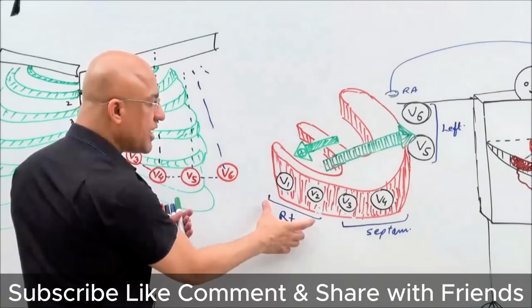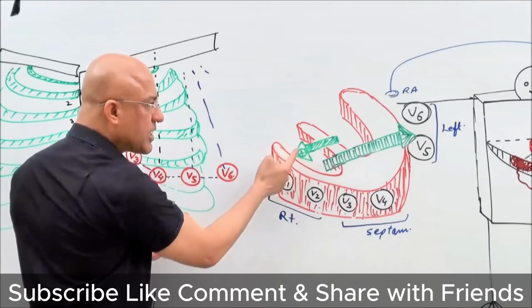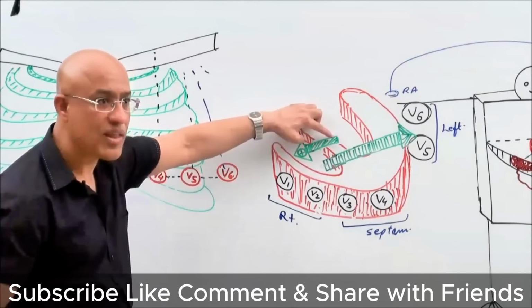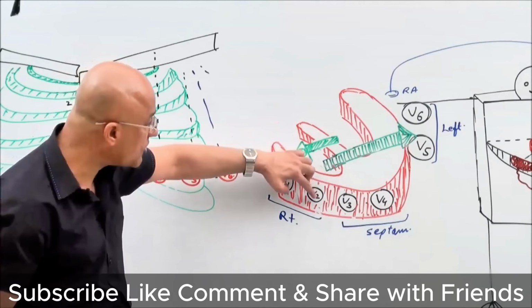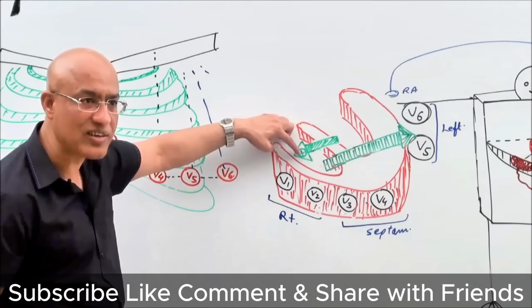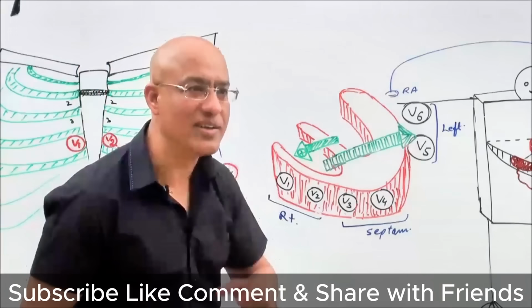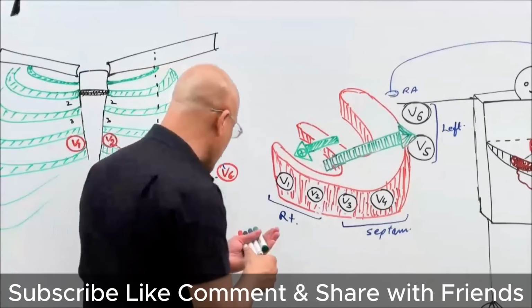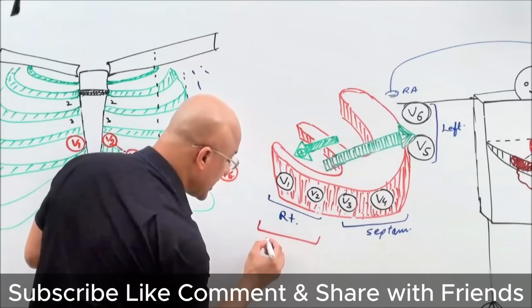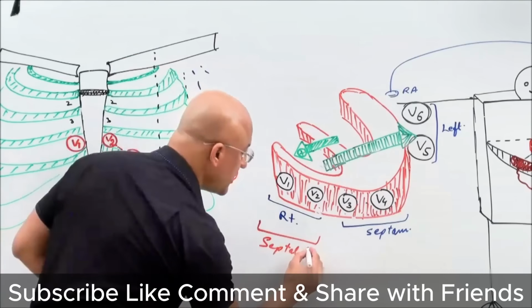Now look here, V1 and V2, right? Even though they're placed over the right side of the heart, they are more sensitive to the septal electrical activity of the heart. They are more sensitive, V1 and V2, to the septal depolarization. That is why functionally they are called septal leads. V1 and V2 functionally are called septal chest leads.